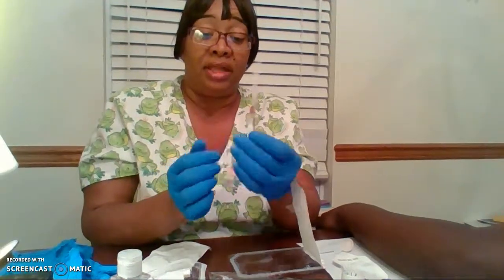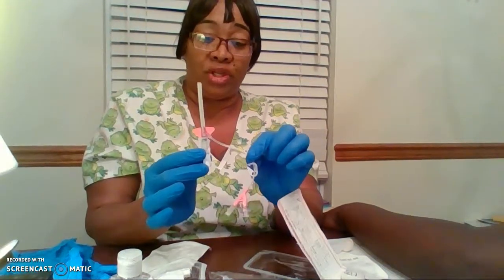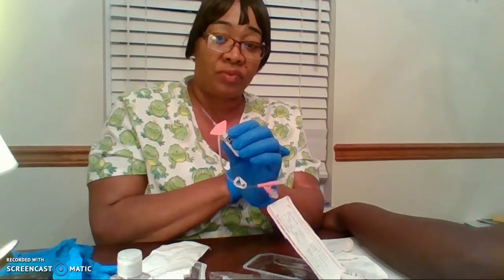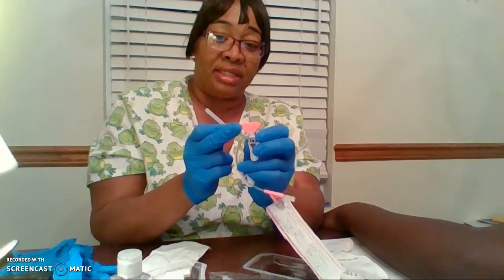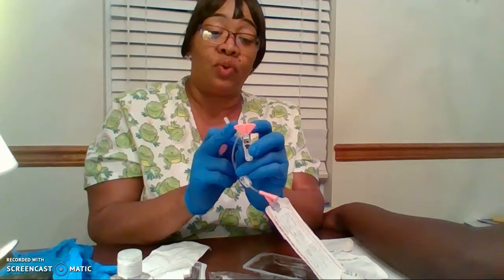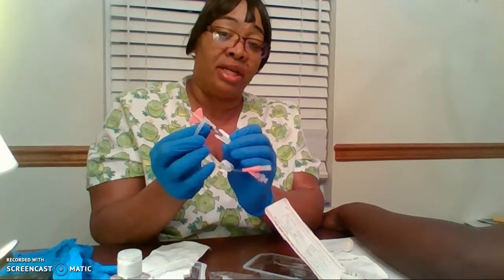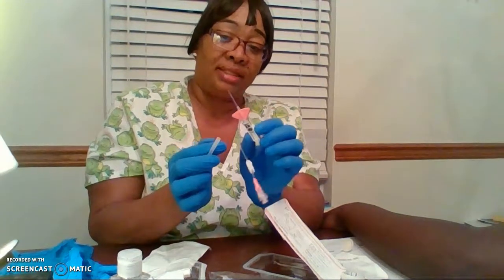So when you open up this particular IV catheter, which I've never seen before, I moved here to Virginia, but this particular catheter has an extension to it, and when you are starting the IV, you're going to insert this needle into the patient's vein. There is a butterfly looking apparatus here that is used for stabilizing the catheter once it is inside of the patient's vein. There is the needle here itself that you can remove once you access the vein.